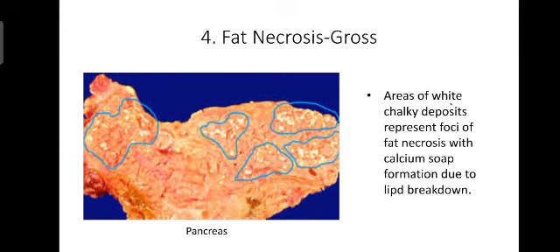Fat necrosis. Fat necrosis is the focal areas of fat destruction resulting from the release of activated lipase. Here the specimen of pancreas shows areas of white chalky deposits, which represent the foci of fat necrosis with calcium soap formation due to the lipid breakdown.